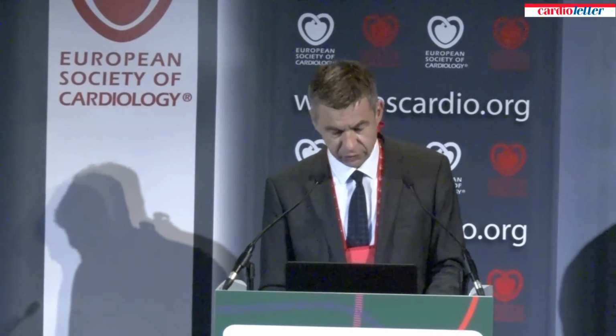Well, interestingly, the pre-PCI OCT run did not really change the procedural strategy, except for more frequent use of 2B3A inhibitors due to the higher rate of thrombus visualized by OCT. Conversely, the post-PCI run of OCT was very informative regarding stent underexpansion, stent malapposition, or incomplete lesion coverage. So that's probably the most important point responsible for the improvement observed in fractional flow reserve. The improvement in the optimization of the stent expansion. Optimization, yes.